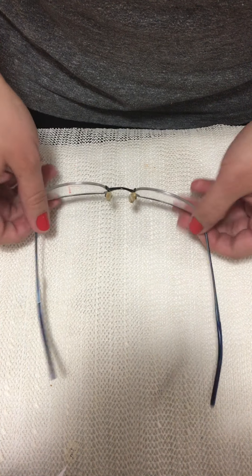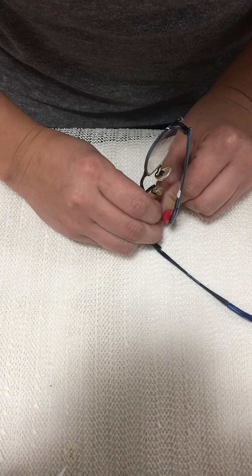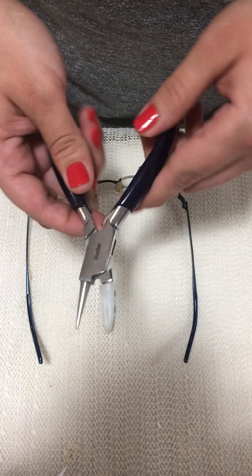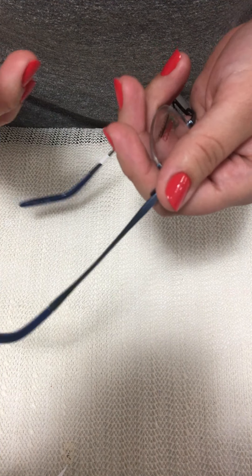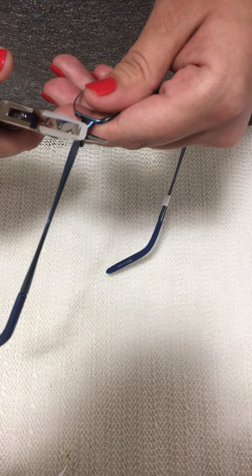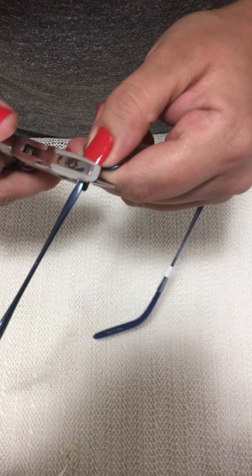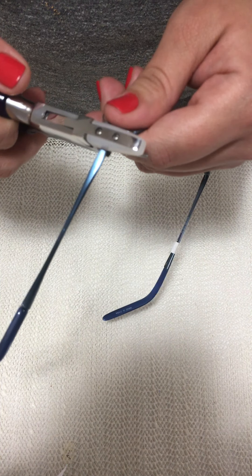To fix it, I can use my thumb to curve it, use a flat surface, or use nylon half-padded pliers. I will hold the frame with the half-padded pliers to fix the misalignment. I'll put the padded side to the outside so I don't ruin the metal, and put pressure with my finger on the end piece so no further misalignments happen.